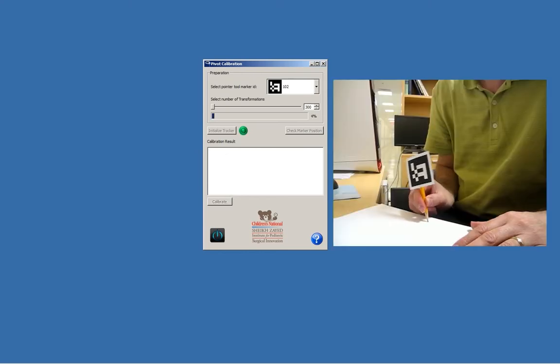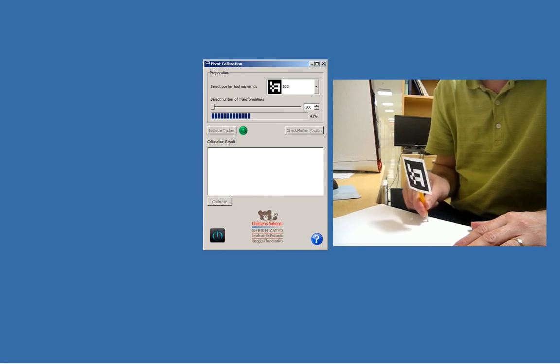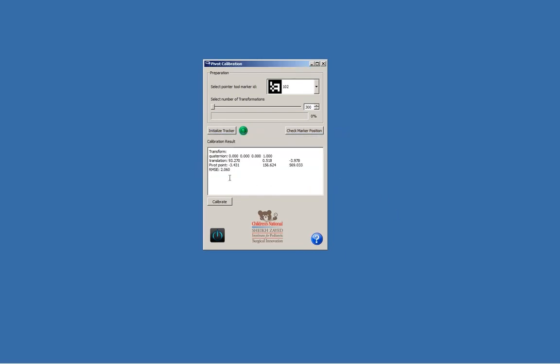Now I'm pivoting. Let's see what we got — it's about two millimeters, which is reasonable and depends on the length of the pencil being used as the pointer. We're done, so we exit the program.